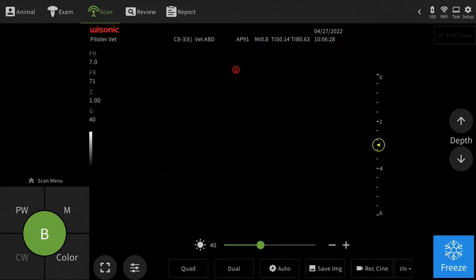Welcome to the Core Learning series. In this video, we'll cover how to download software into your Piloter from the cloud.